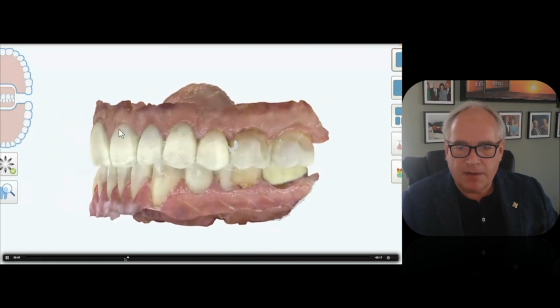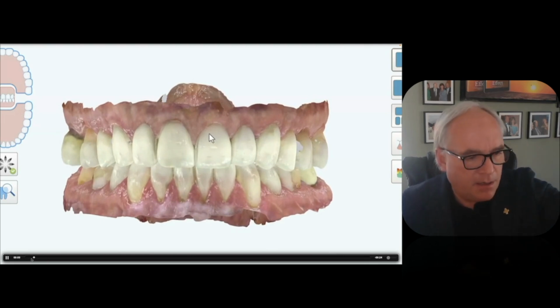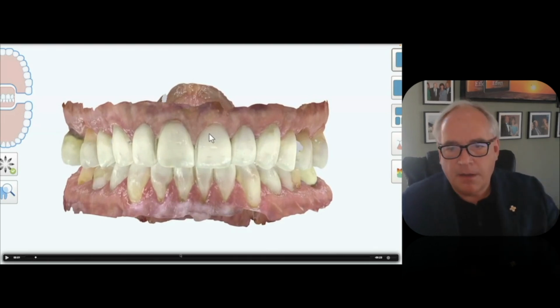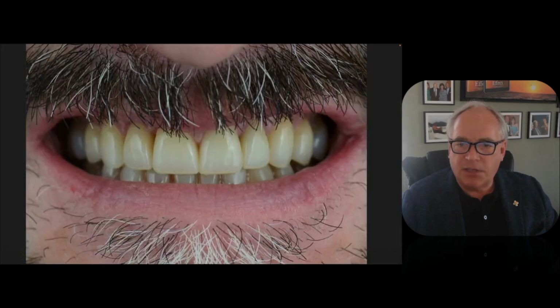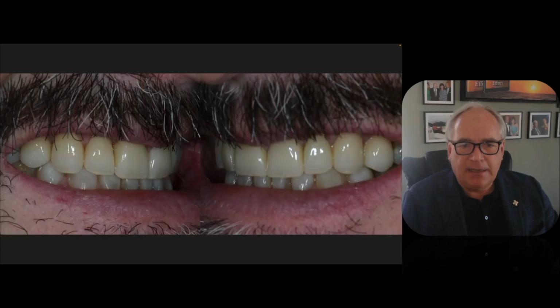But if we look right back to essentially where we started, you look at those contours and look at it in the mouth. There's a little bit more width because we brought things forward a little bit. Our patient here thought the provisionals were a little light, so we toned things down. But again, toppers in the back. Final restorations, first molar, first bite up top.